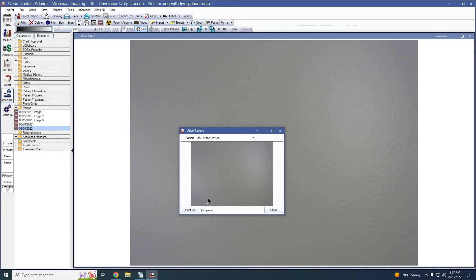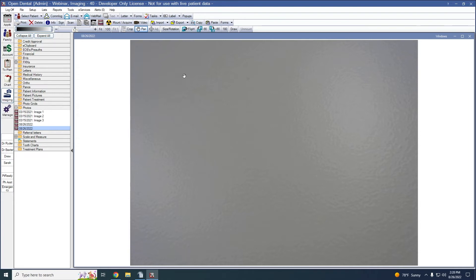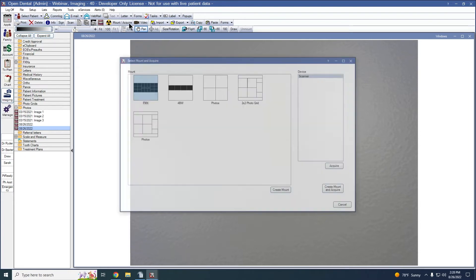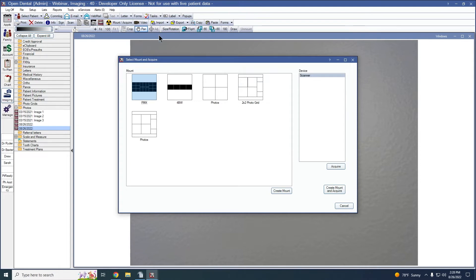If no default category for video capture is set, then the image will save to the selected imaging category. If no imaging category is selected, then the image will save to the default image category set in the imaging preferences. And if there is no default image category, then the image will save to the top-most imaging category. To capture an image with an existing radiography sensor, click the mount acquire button on the imaging module toolbar. To acquire a single item, select the device and click acquire. The mount will be added to the default imaging category; if no category is selected, it will go into the default image category set in the imaging preferences. And if there is no default image category set, it will save to the top-most image category.